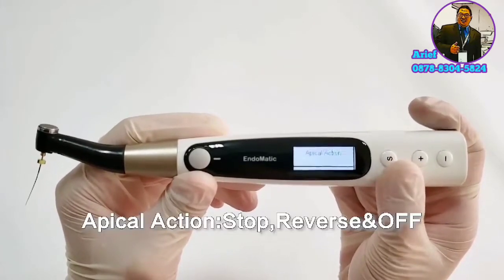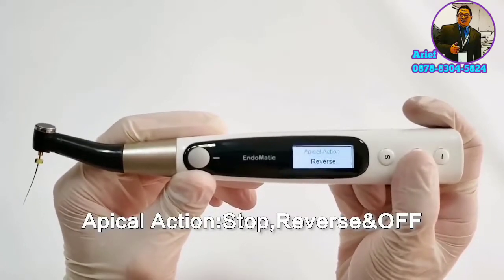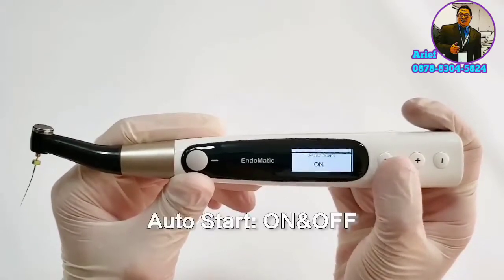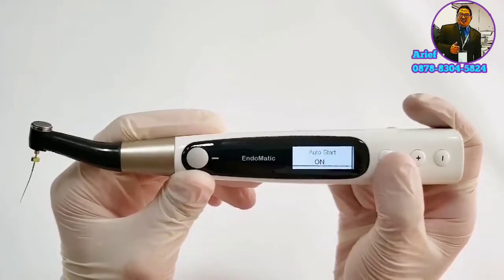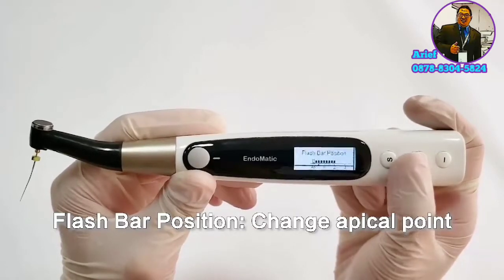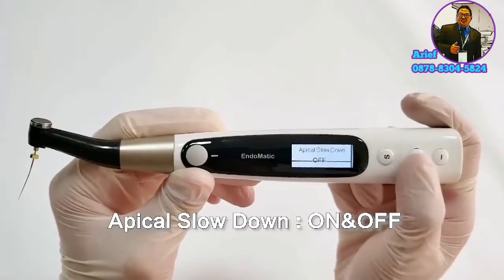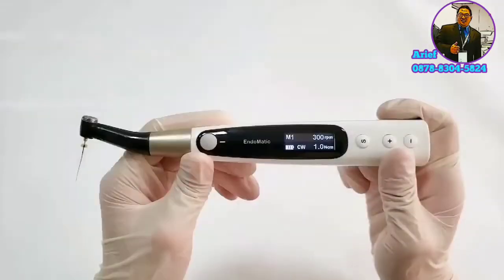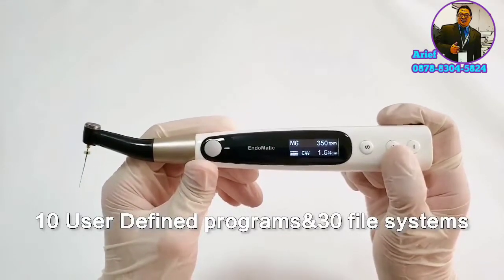Next mode is apical action mode, including stop, reverse, and off. Then next is auto start mode, including on and off. Next is flash bar position, to change the apical point. Apical slowdown includes on and off modes. And the menu includes preset 10 user-defined programs and 30 file systems — you can select different file systems according to your demand.